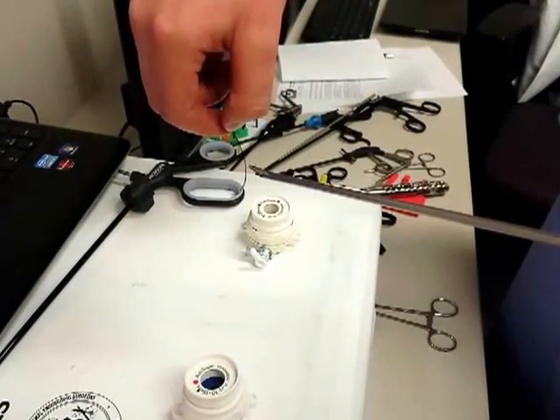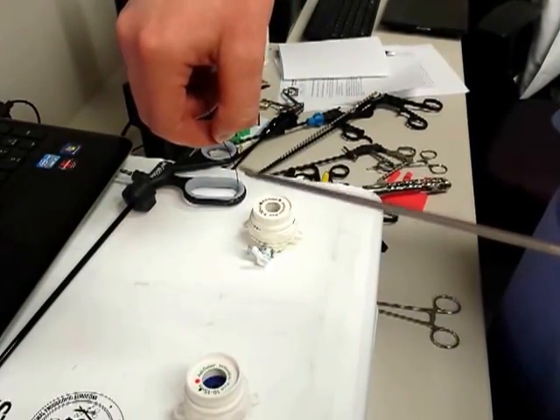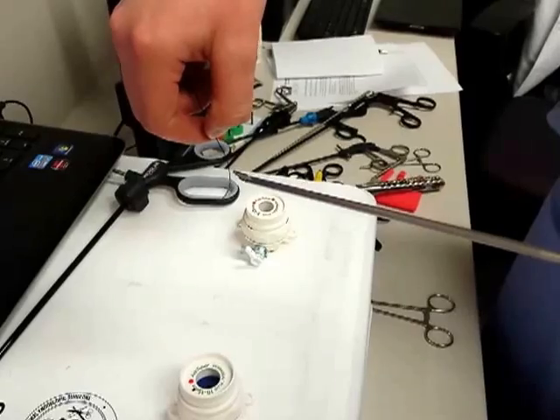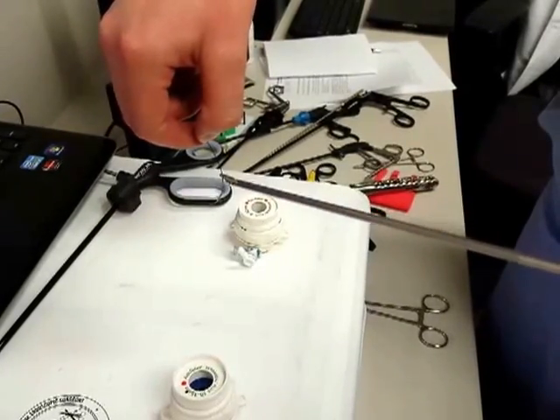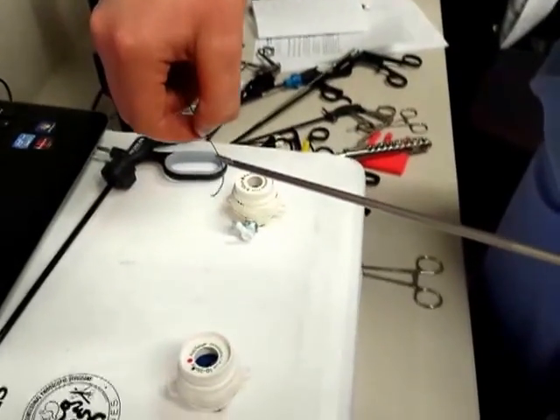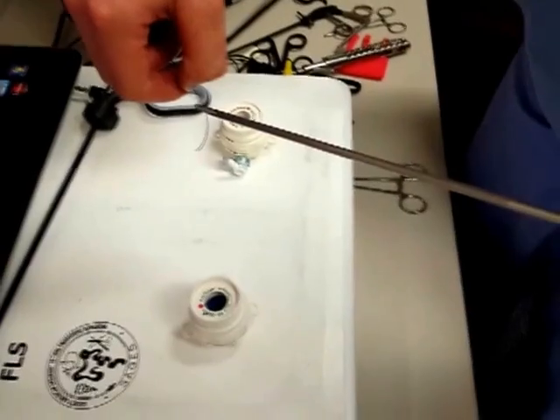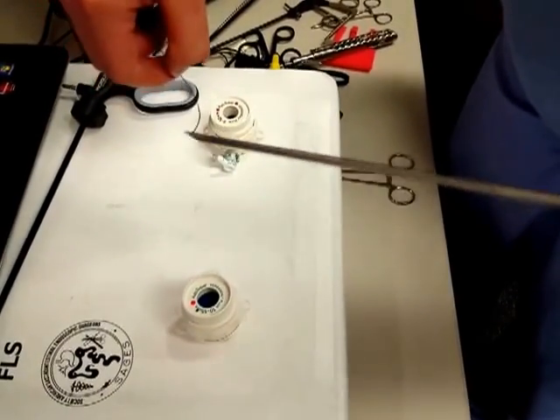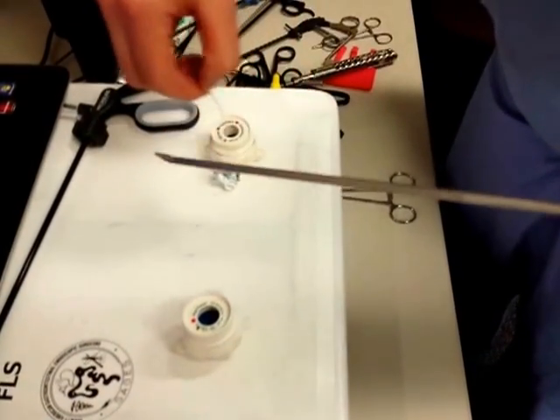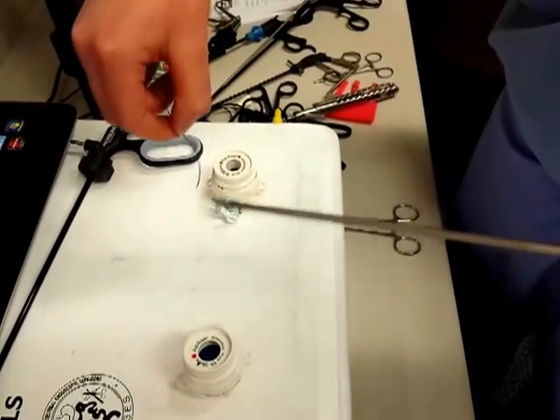For this exercise, the intracorporeal knot, we recommend that you start by setting the needle into the non-dominant needle driver in such a fashion that it will be easier to load once it is introduced into the box. In order to do this, hold the needle driver in your non-dominant hand at the angle at which it will enter the box.